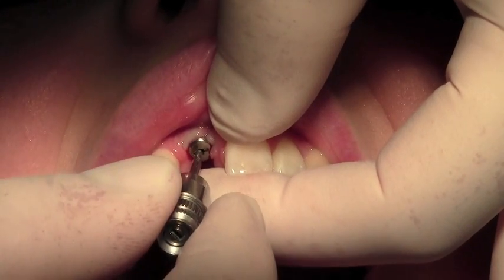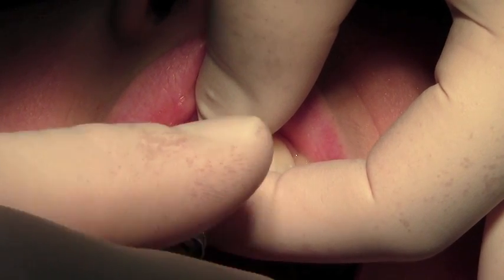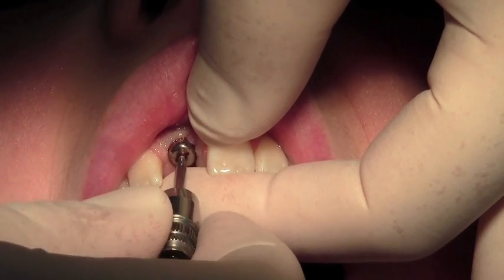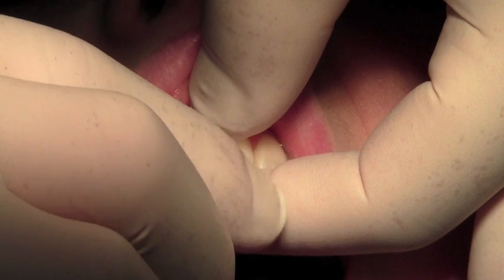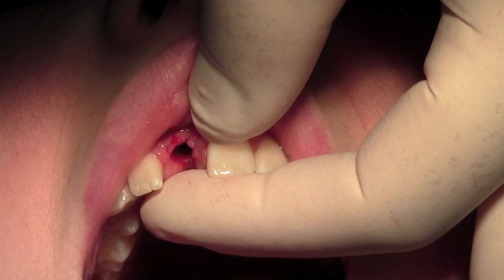What we're going to do is remove the healing cap, and for this I'm using the smaller driver — the 0.9mm driver — and that comes off nice and easily. Pass that across to Lisa.